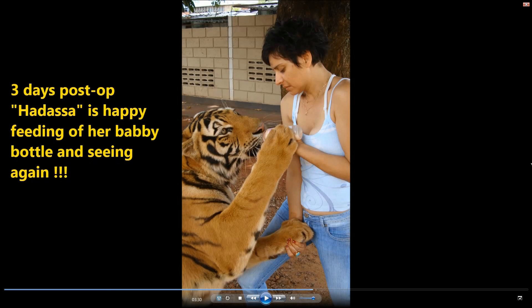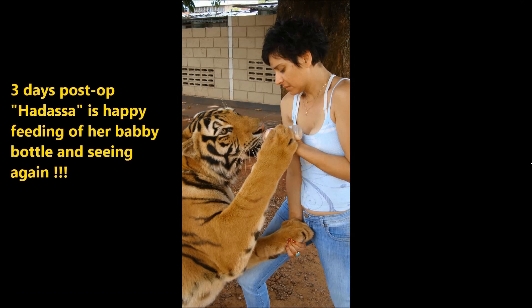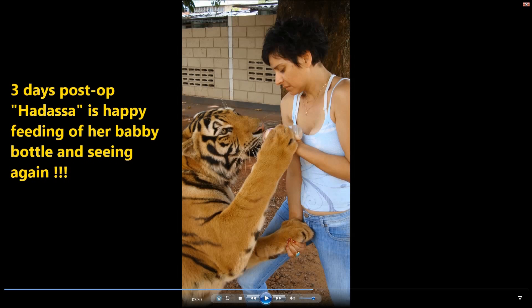This is an image 3 days post-op. Hadassa was the name of the patient — she was being hand-fed with a baby bottle, and that is the way we trained the tiger to accept the eye drops. This is the owner here, and you can appreciate how calm the eyes are. She was seeing quite well 3 days after the procedure.